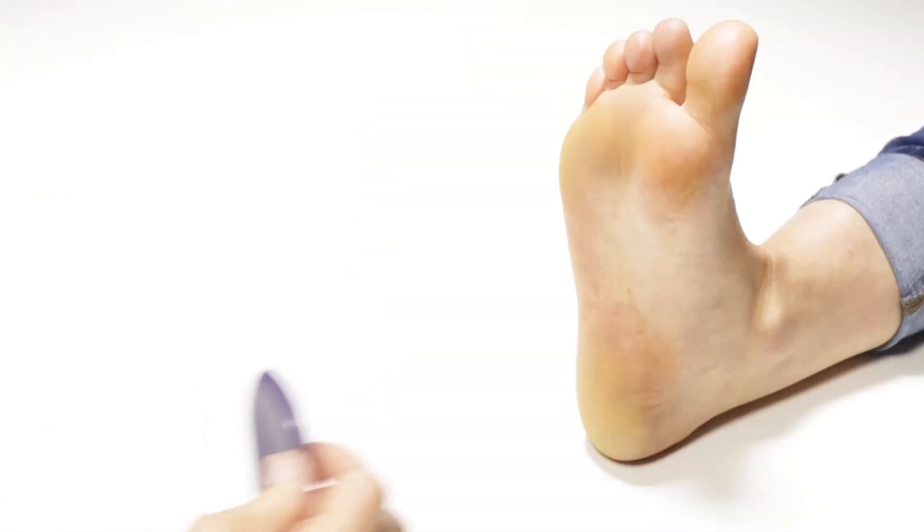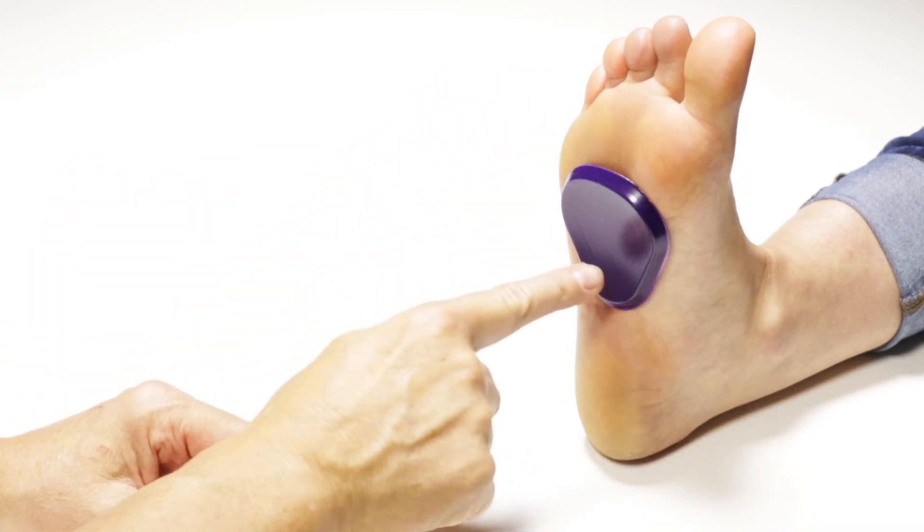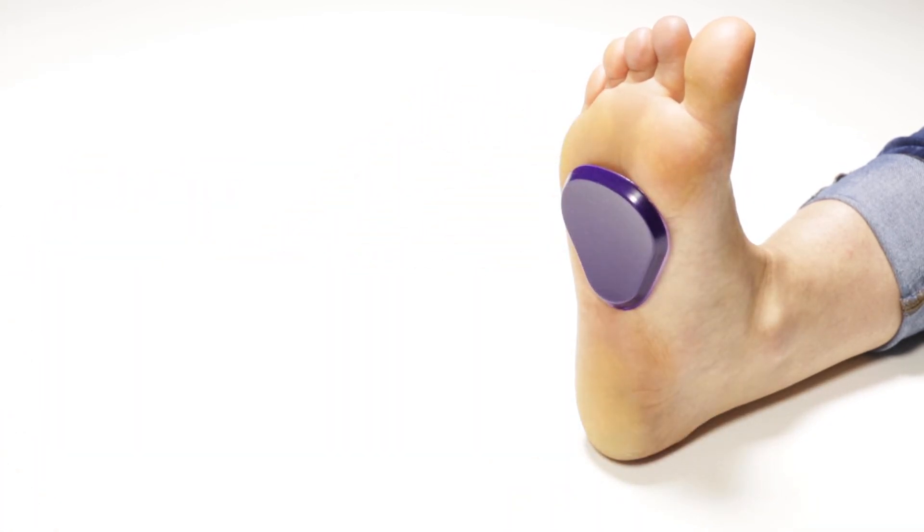When applying the Reusable Gel Metatarsal Pads directly to the foot, identify the weight-bearing surface of the forefoot and apply the pad immediately proximal to the weight-bearing surface of the forefoot.